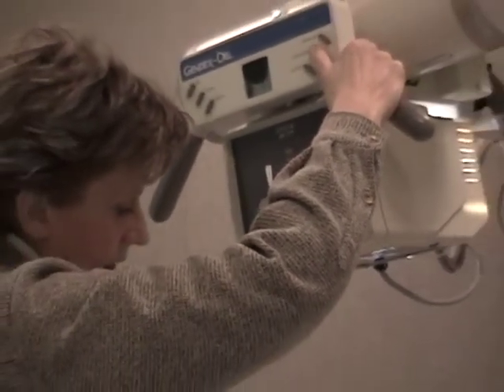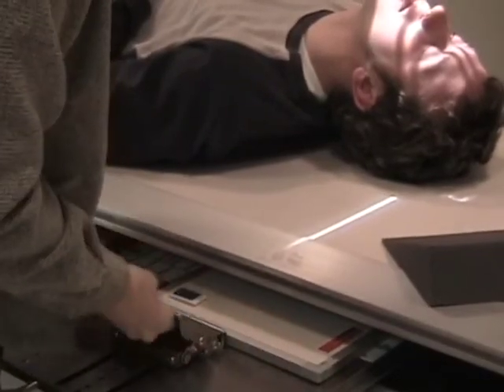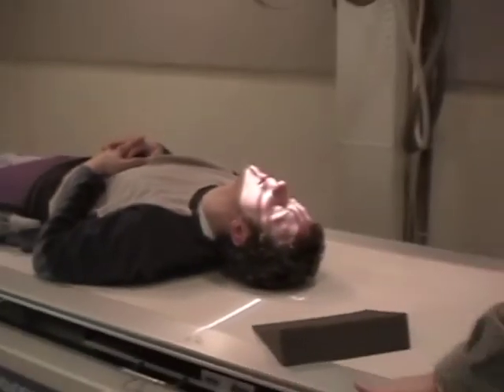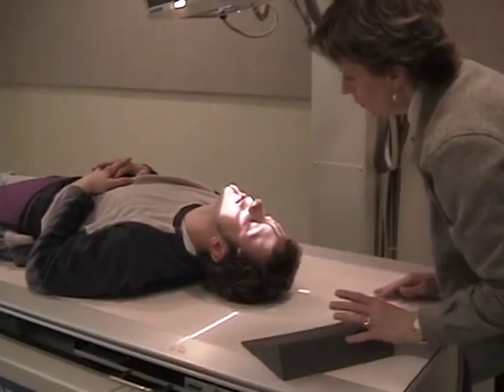And again, I'd exit at the same level, or enter at the same level, entering at the acanthion, exiting to the center of the film. And then I go check the MSP for centering and to make sure there's no evidence of rotation. And that would be a reverse Waters that you could use in the case of trauma.